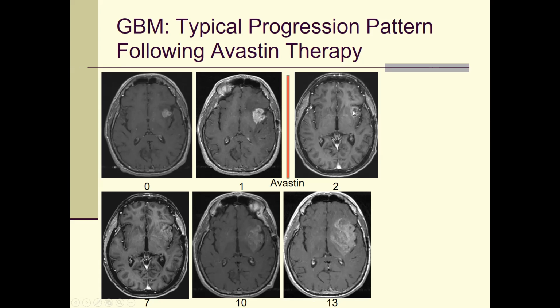But if you do a follow-up, it never comes back to this, even when you have a recurrent tumor. The amount of enhancement can stay very decreased. So if you're not paying attention, it's a very subtle enhancement.